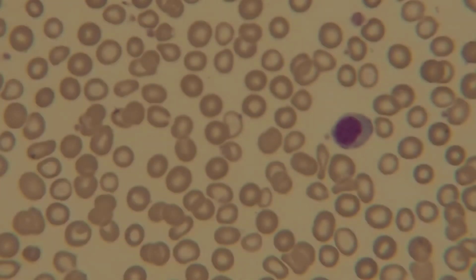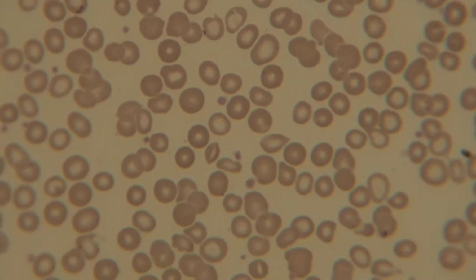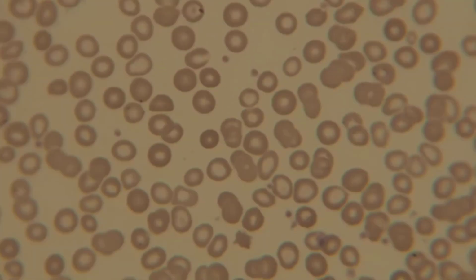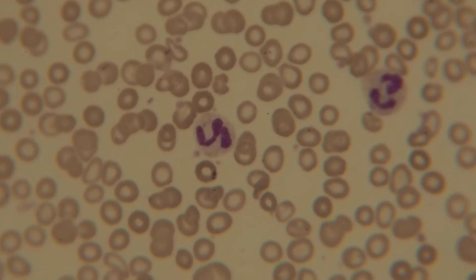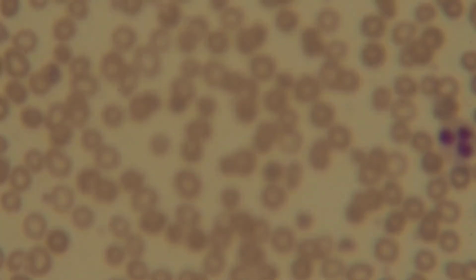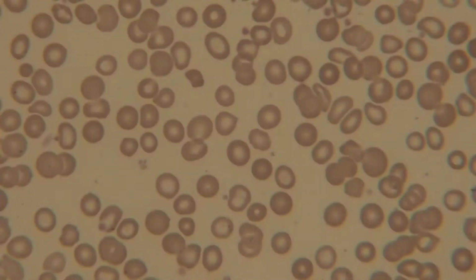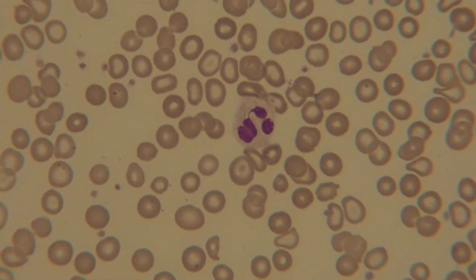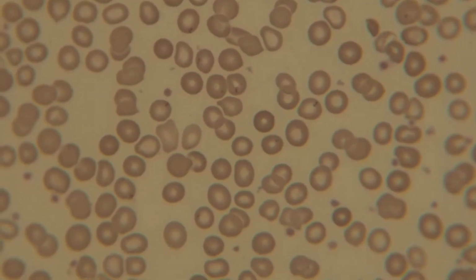I'm trying to bring you back. Okay. Lymphocyte. Lymphocyte. Neutrophil, neutrophil. Neutrophil. Neutrophil. Lymphocyte.